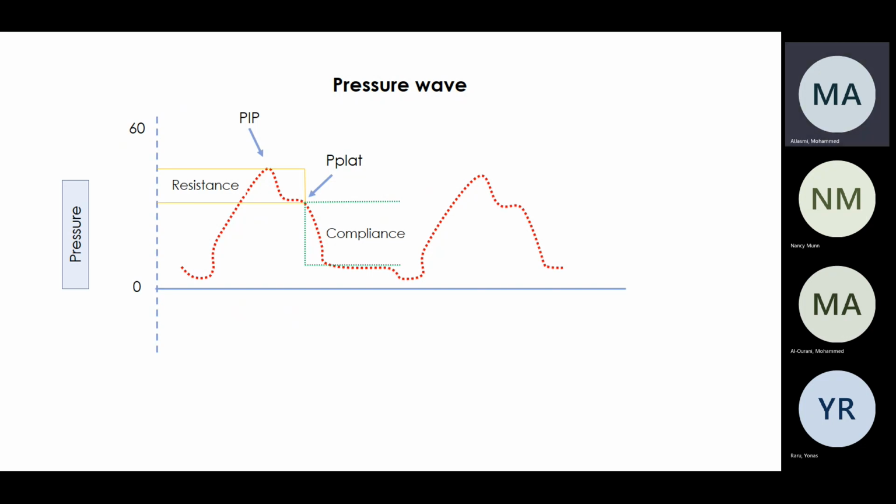Okay. So if I come today and we measure the resistance, and the resistance is, say, 20, and tomorrow I come and think this patient is improving dramatically, and I measure the resistance and it's still 20, there's no improvement, is that right? So you need to make sure my resistance is going down or not. So how can we calculate resistance?